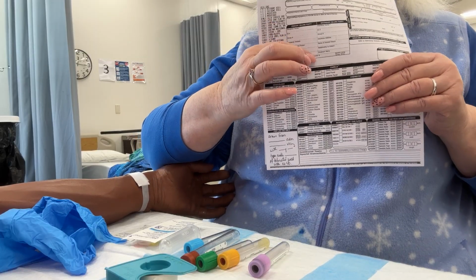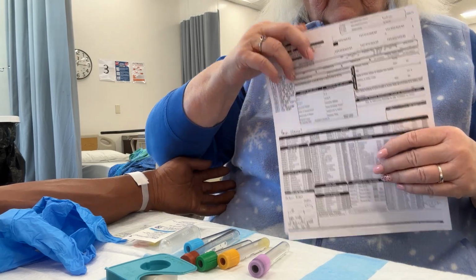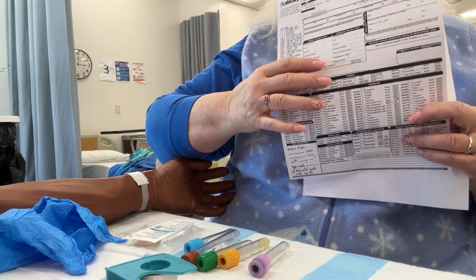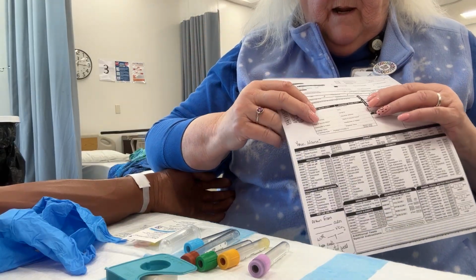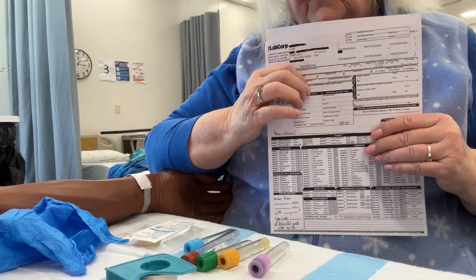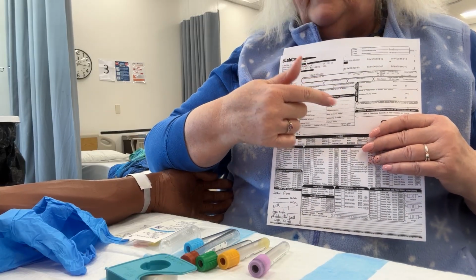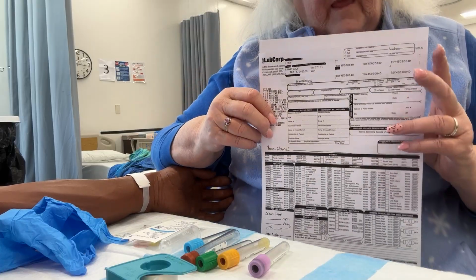Your name is here. You're going to use this information to complete the lab slip with the patient name, their demographic information, their ID, the physician's ID number. You're going to sign for the physician, and then you'll put slash your name. That's how we identify that it was us signing for the physician.